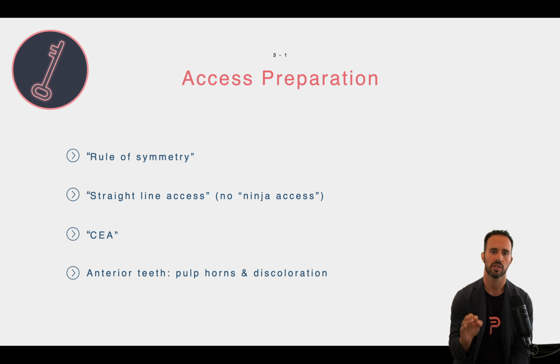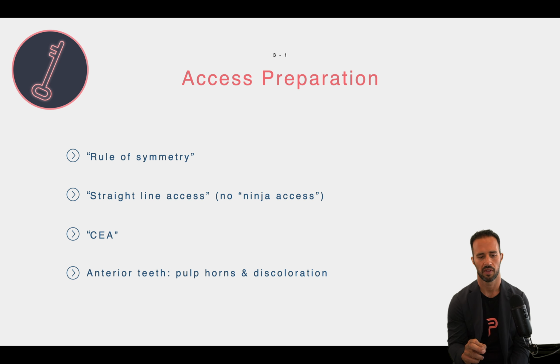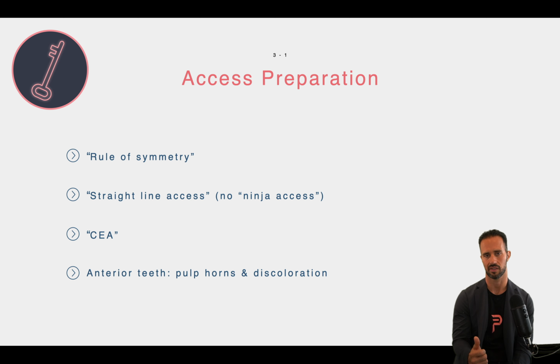Nevertheless, it's really reserved for specific cases, and I would not encourage you to perform these, what they call contracted endodontic cavities or conservative access preparations, in your practices unless you have a ton of experience, because it's very easy to miss canals, it's very easy to perforate teeth, and it's very easy to not fully debride and disinfect the root canal spaces when you have these tiny little access preparations.